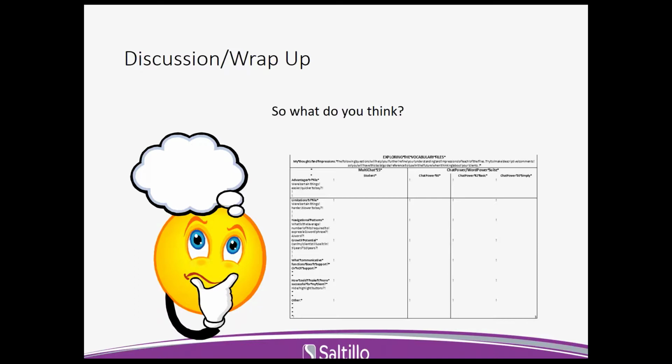Did you see growth potential? So as a child starts to grow their language, are they able to do that with that vocabulary file and not have to relearn a system, relearn the motor plan of where things are for that consistency? And did you have a preference? And why did you prefer a vocabulary file one over the other? Did you start to think about, is there one that might work better for one student and one that might be better for another?